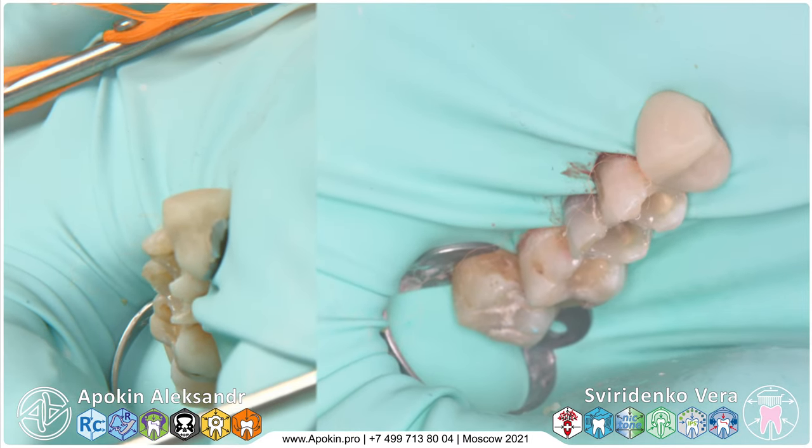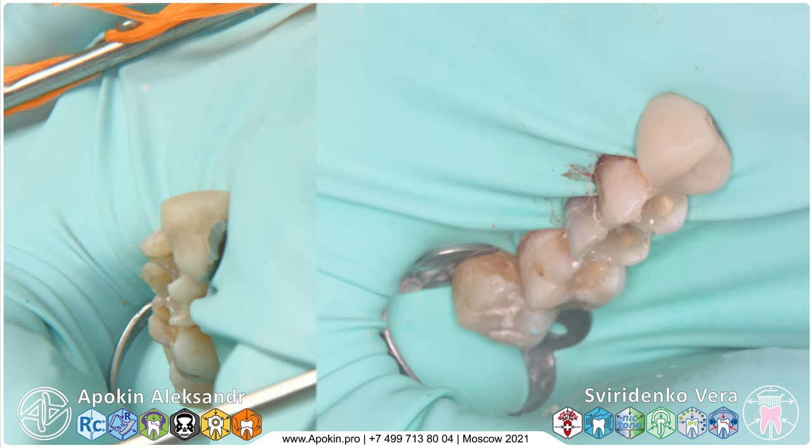So then we fill it with the temporary material and plan our next visit.